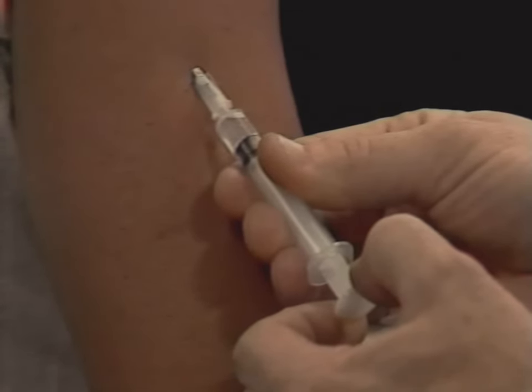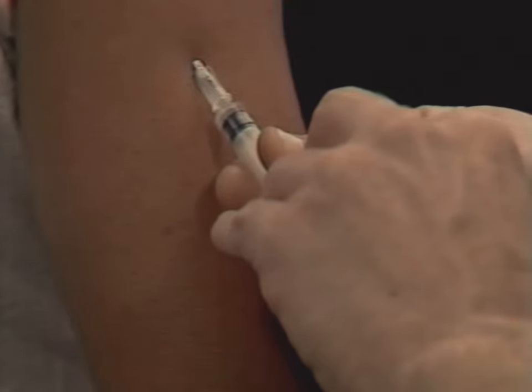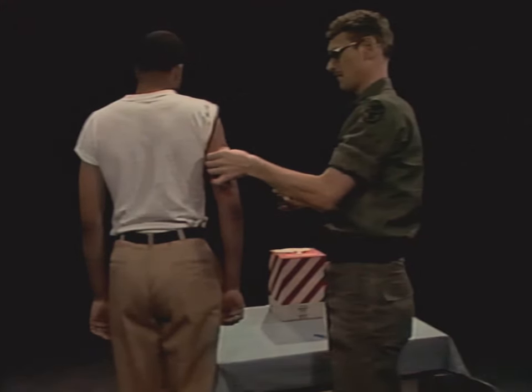If no blood appears in the syringe when you aspirate, press the plunger into the barrel slowly and steadily until all the medication is injected. Then put an alcohol sponge over the site and quickly remove the needle.